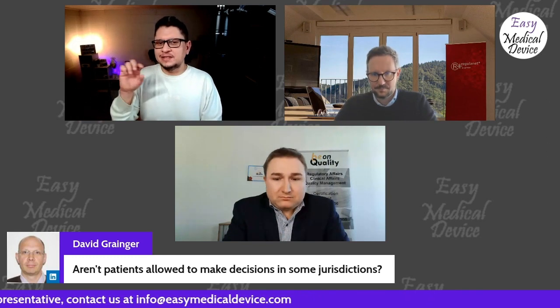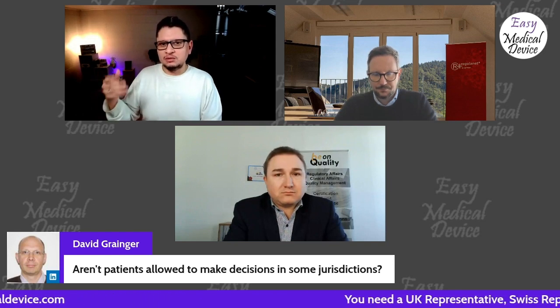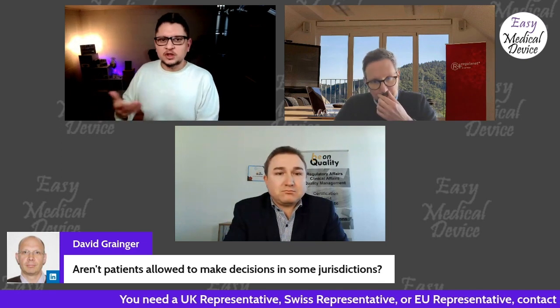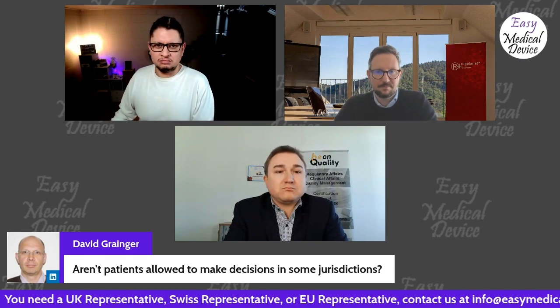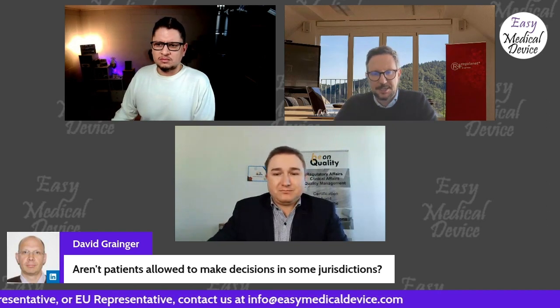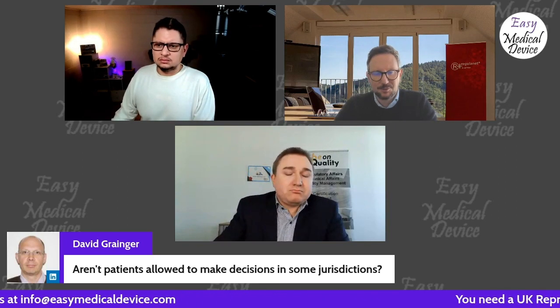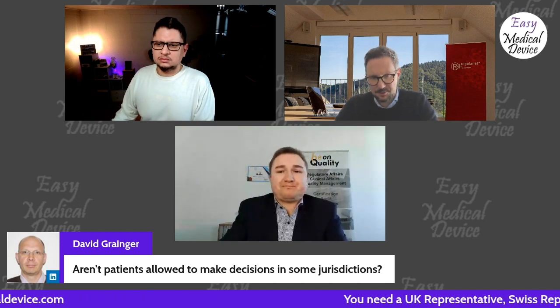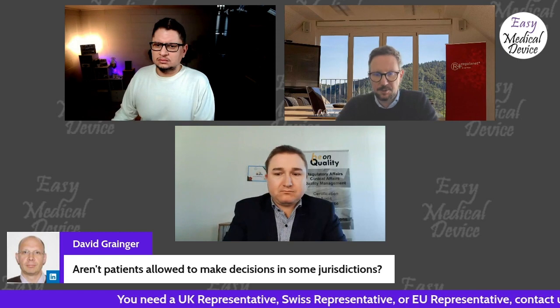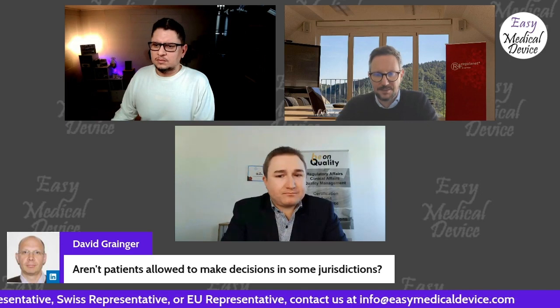I mean, they always put this disclaimer that all information provided can be used as information only. If you really want something, you have to go to a physician, etc. So mainly this is also something that the manufacturers have to place on their product to be on the safe side. Otherwise, you also cannot conduct your usability testing. You have to define your user profile, and therefore you need to define in your labeling, in your instructions for use, who is your intended user, and therefore you will also create your usability testing for that. So it's definitely mandatory to have this defined.